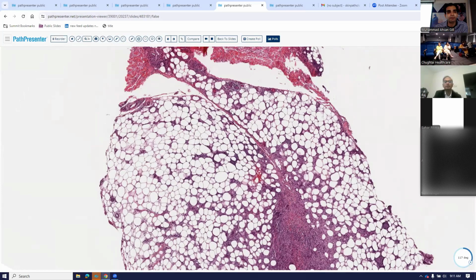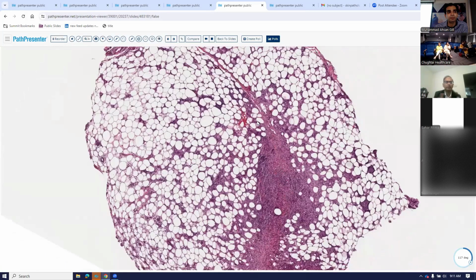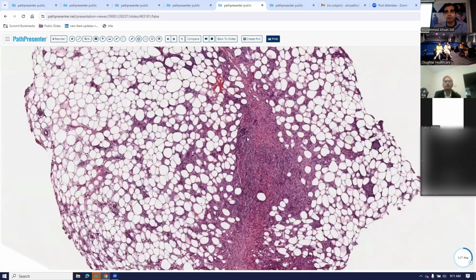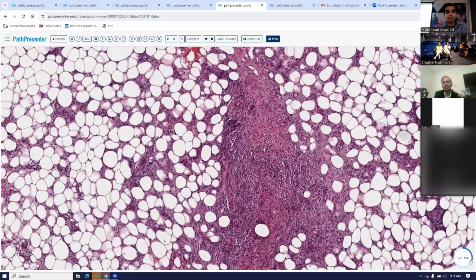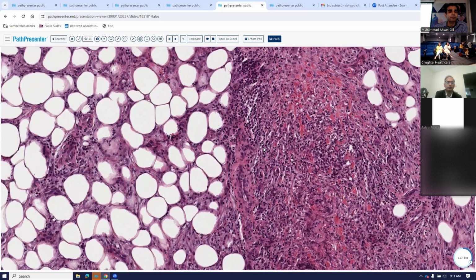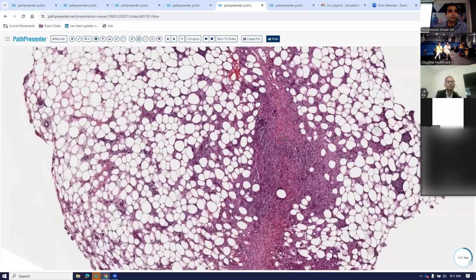But in this condition, what is happening is that the septa become quite widened and fibrotic. So you can see that this is a widened and fibrotic septa here. And then within the septa, I see a lot of inflammation. So you can see lymphocytes, giant cells, plasma cells, sometimes even eosinophils, but it is acute and chronic inflammation within the septa that is thickened and fibrotic. Some of this inflammation might start going into the lobules, but mostly the lobules look pretty normal.